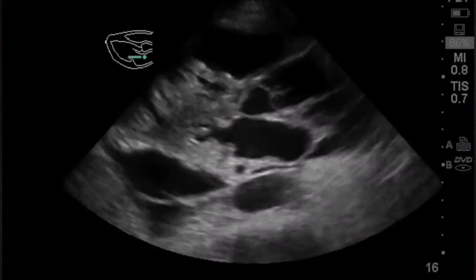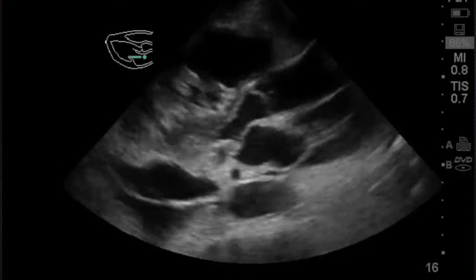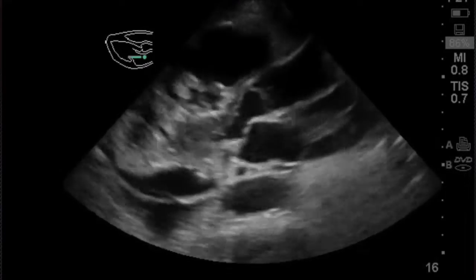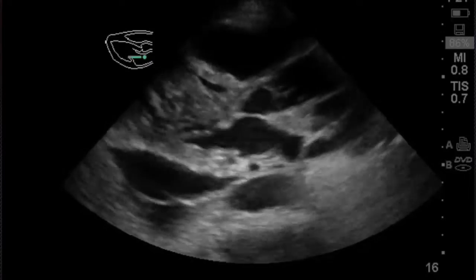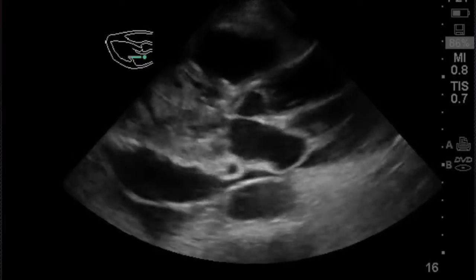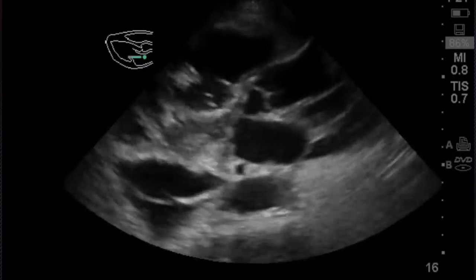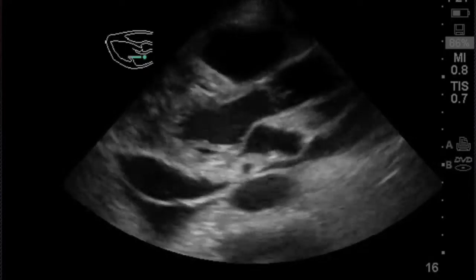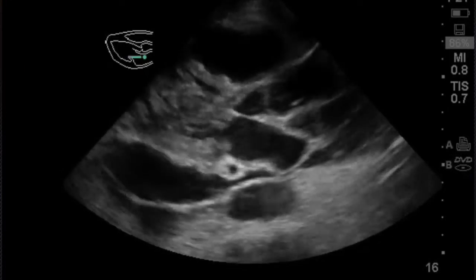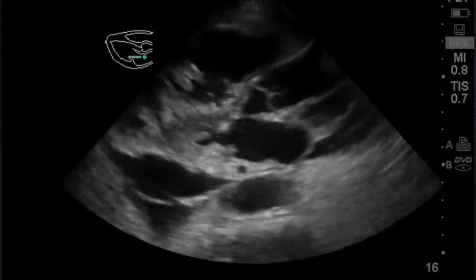Okay, so in this case, this is a very poorly patient, and this is a parasternal long axis. Now you can see that you can make out where the left atrium is, the mitral valve. The internal chamber of the left ventricle looks like it's quite collapsed and very narrow, and there's the aortic valve and aortic roots in there with the right ventricular outflow tract on top. So it is the parasternal long axis view, but it does look very unusual because you've only seen normal ones before.